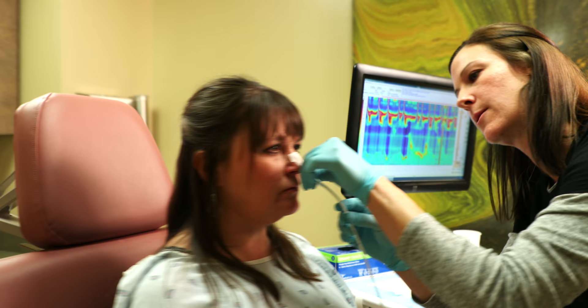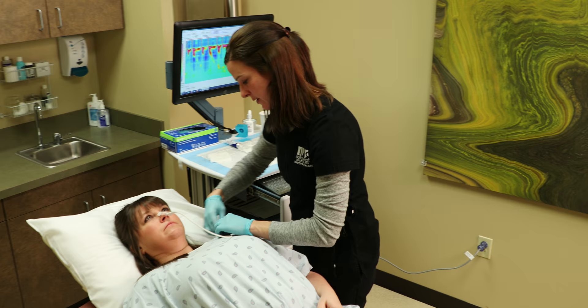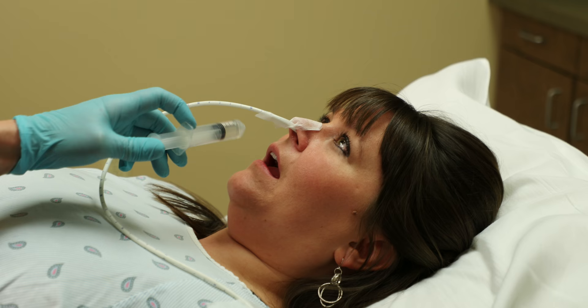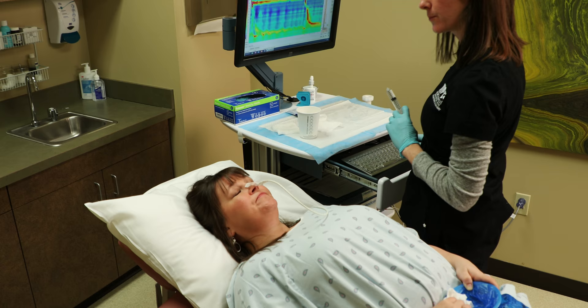It's important to remain calm during the procedure by taking slow deep breaths. This test will not interfere with your breathing. Once the nurse has determined proper placement of your catheter, tape will be applied to your nose to secure the catheter in place. You will then lay flat for the duration of the test.